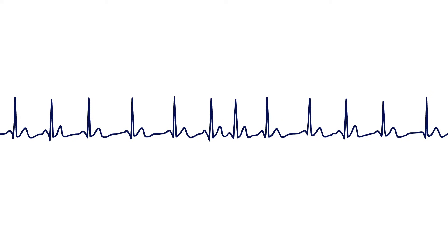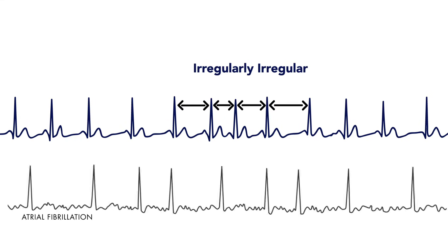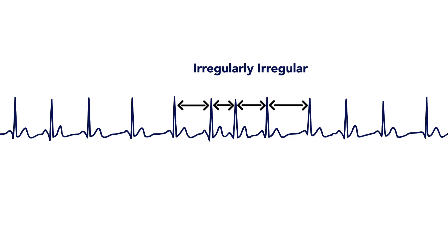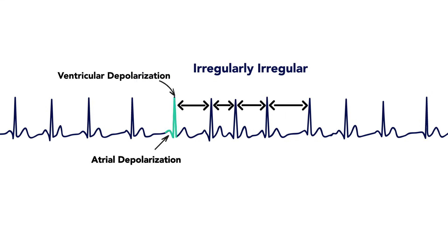The next thing to notice is that ventricular rate is irregular. You might even be tempted to call this atrial fibrillation at first. However, the difference between this rhythm and atrial fibrillation is that with atrial fibrillation there's really no identifiable P wave, whereas in multifocal atrial tachycardia you can reliably see the progression of depolarization from atria to ventricles.